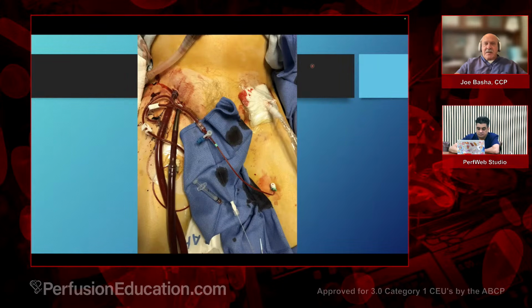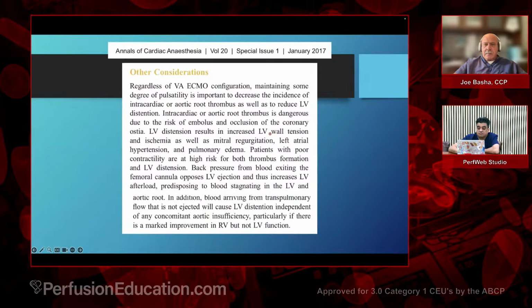Here's another example of what we frequently see, and you can see that you can have an SFA line in either side. You can run these things any direction that you need to in order to accomplish your goal of peripheral cannulation. Here, this is a balloon pump. This is not Impella. It's also obstructing the artery, and so they put this in the SFA line, just quite distal.